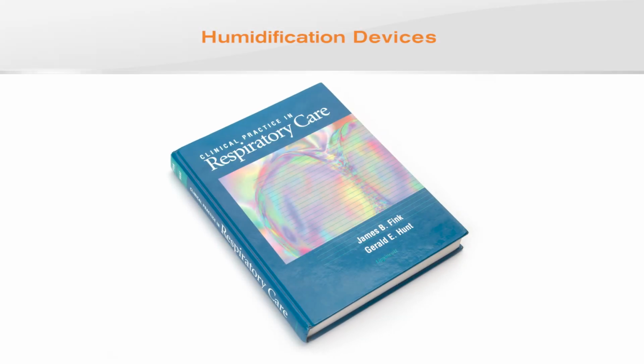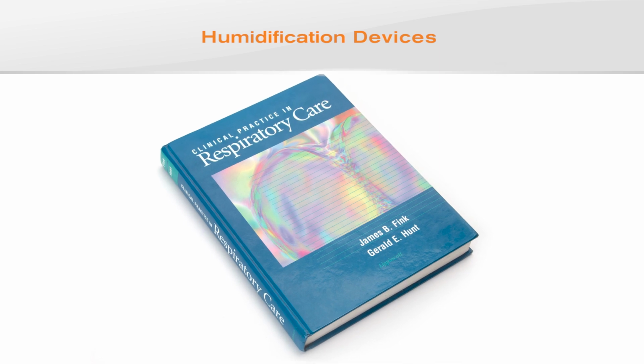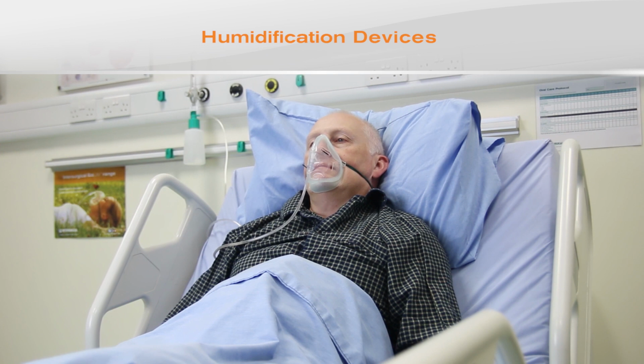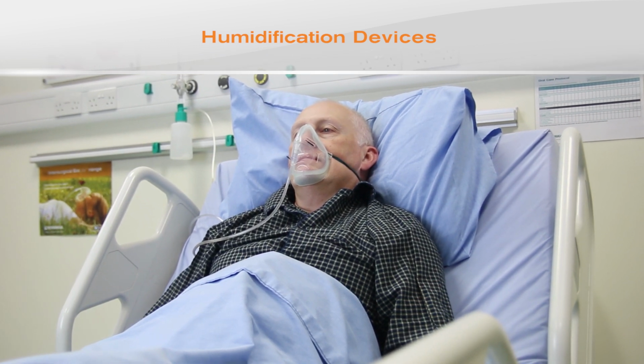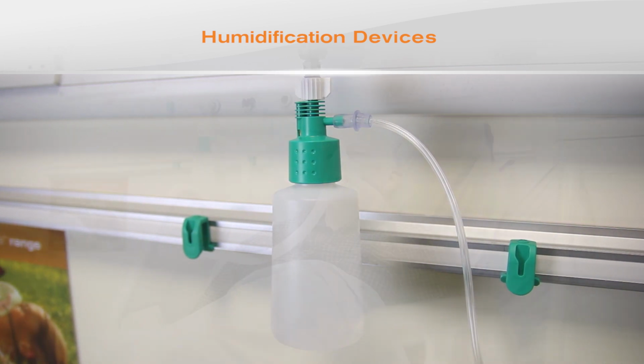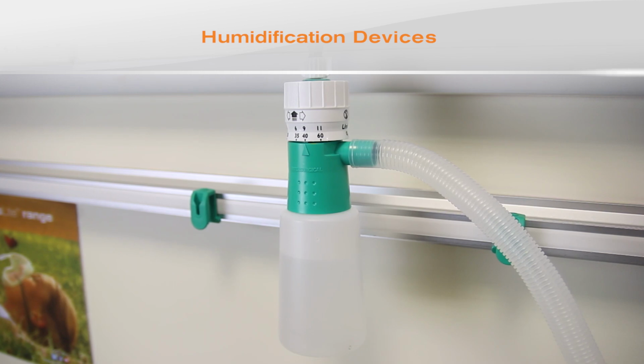Fink and Hunt in Clinical Practice in Respiratory Care describe the two most commonly used devices in this category as follows. A humidifier is a device that adds molecular water to gas, whereas a nebulizer produces an aerosol or suspension of particles in gas.